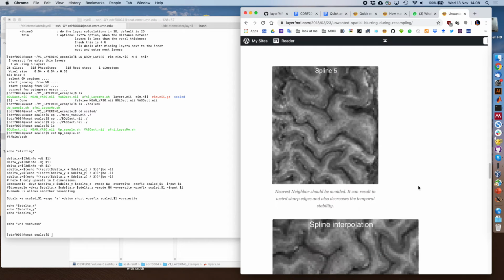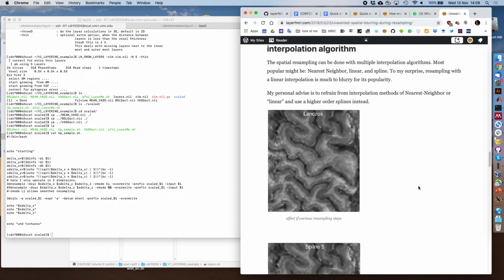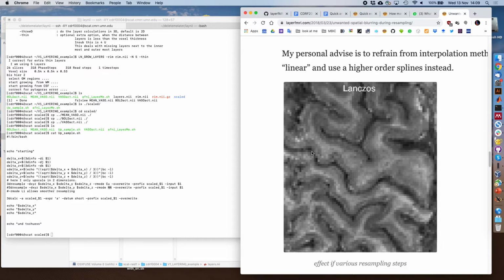Sure. And you asked about, yesterday you showed a very nice spider graph, different sequences, different strengths and weaknesses. You could make the same type of spider graph for interpolation methods. Absolutely, right? Yeah.